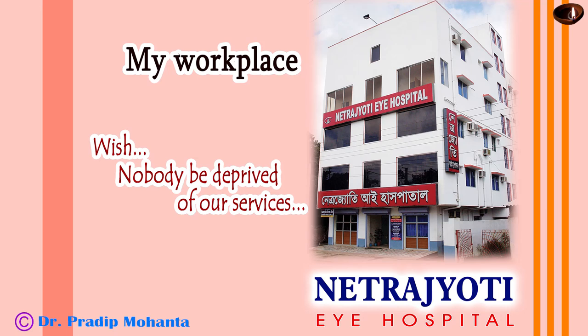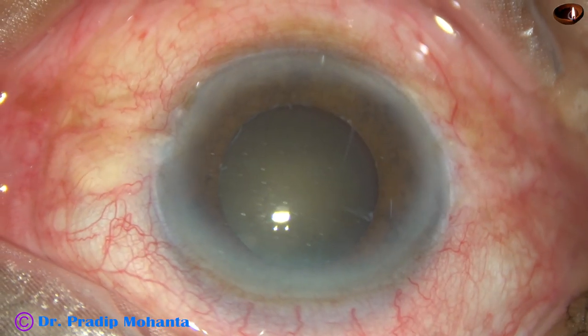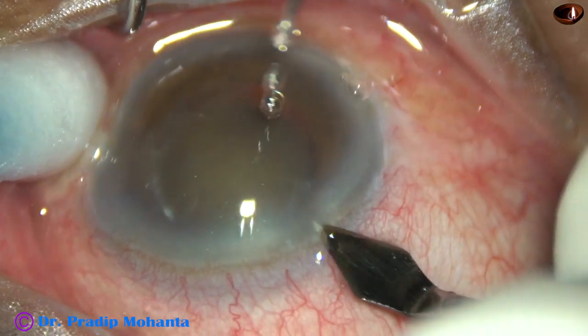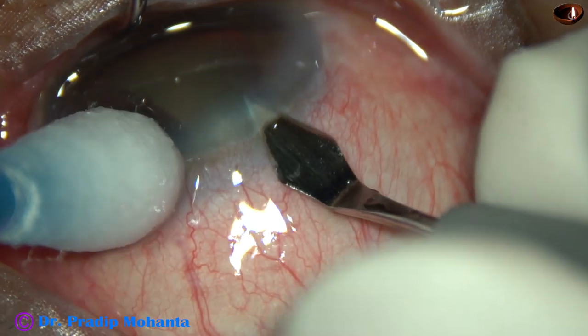Friends, welcome to my workplace at Ranaghat, West Bengal, India. This is a cataract with grade 4 nucleus sclerosis, pseudo exfoliation, mid-dilated pupil, and weak zonule.